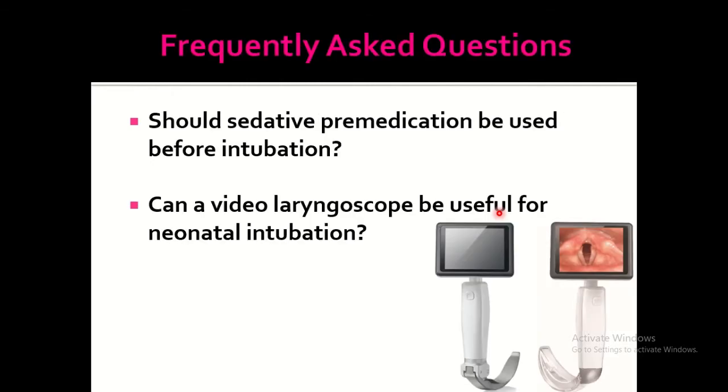And should sedative and pre-medications be used before intubation? Absolutely not, it is an emergency situation, not an elective process. It's not necessary to use sedative medications. Would a video laryngoscope be useful for neonatal intubation? Absolutely.